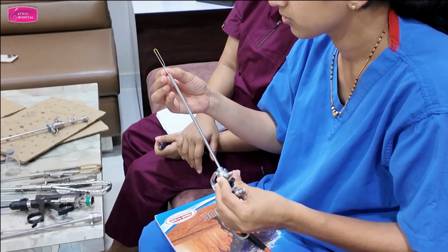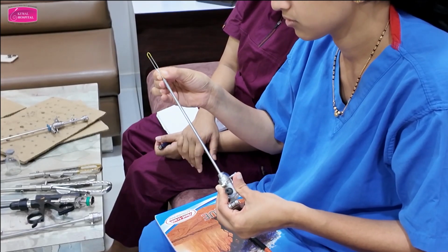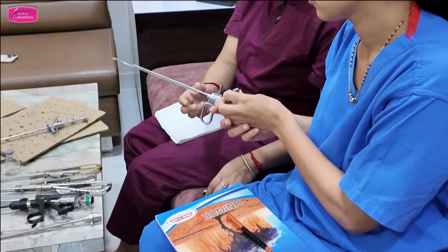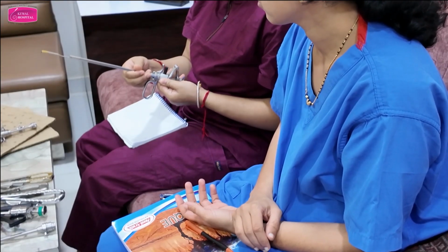Yes, good. Give it to her. Do it once. Press. Take it out.